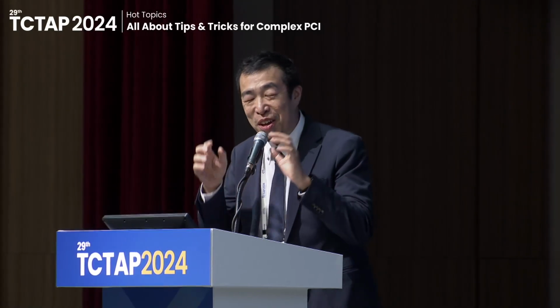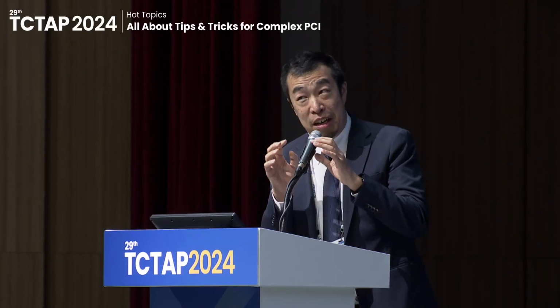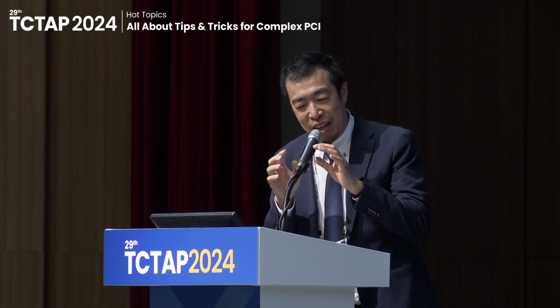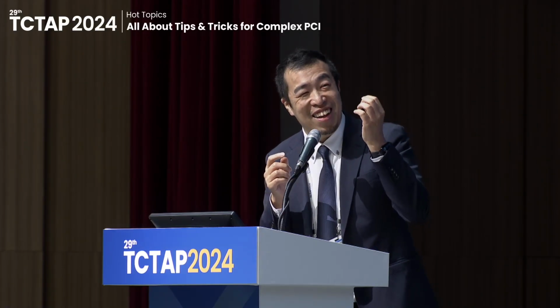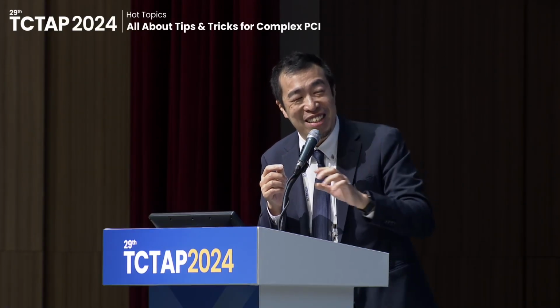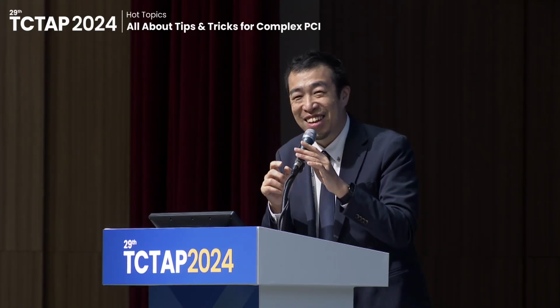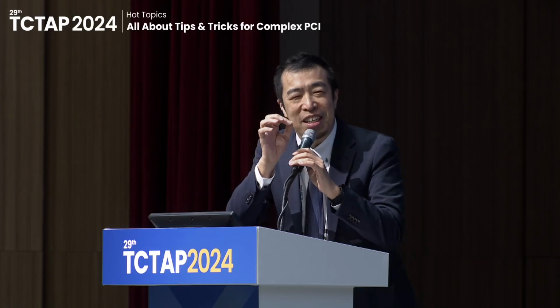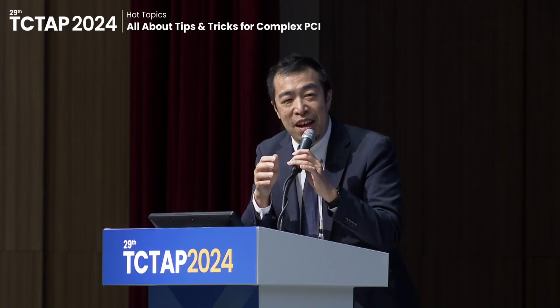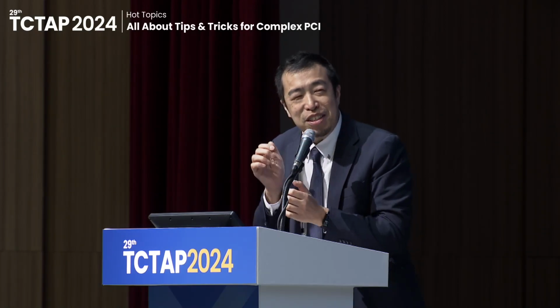Yes, I understand. For the first question, detection of the perforation site is very important. The next question is about the proximal part. The microcatheter has a hole. At that time, of course, it might be effective, but I have never experienced that. Also, the lumen is relatively small, and the patient's blood pressure is not enough to perfuse, even with a small hole. So I think injection is more reliable.